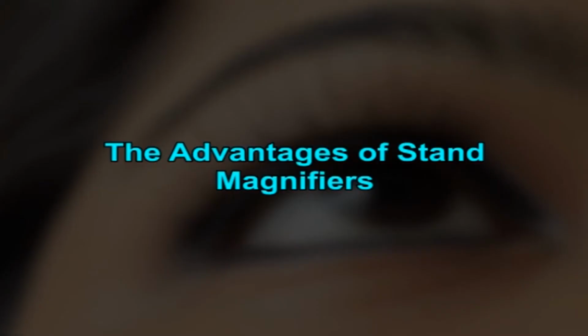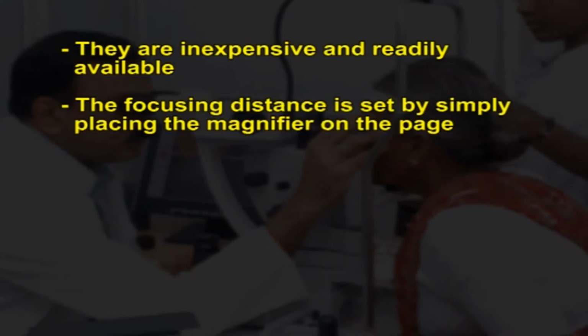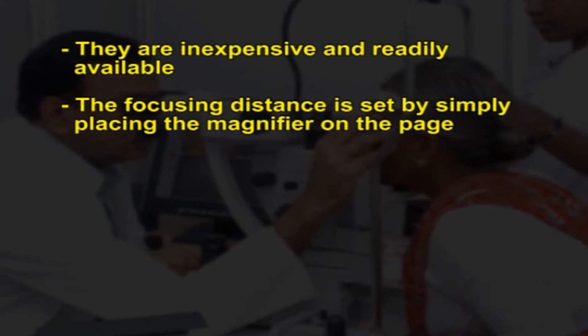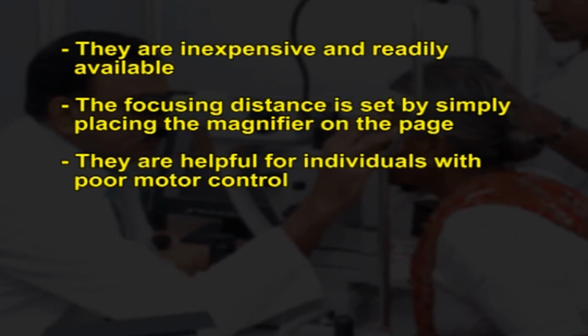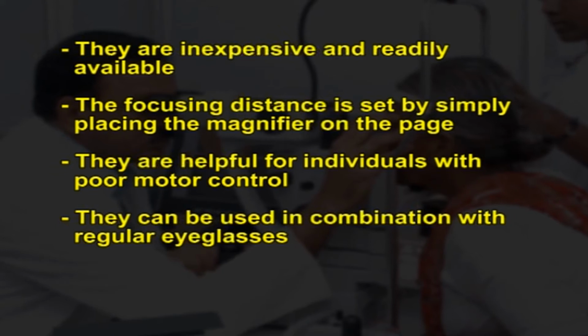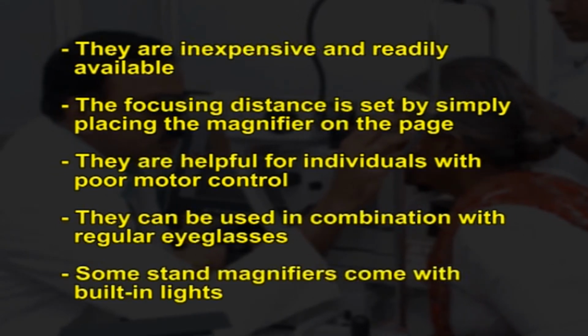The advantages of stand magnifiers are, they are inexpensive and readily available. The focusing distance is set by simply placing the magnifier on the page. They are helpful for individuals with poor motor control. They can be used in combination with regular glasses. Some stand magnifiers come with built-in lights.